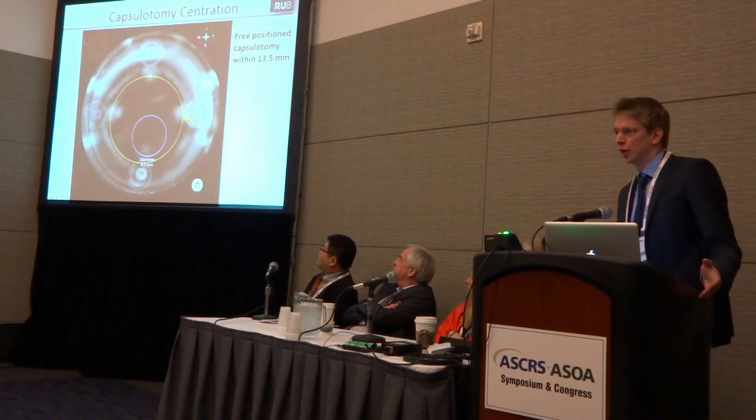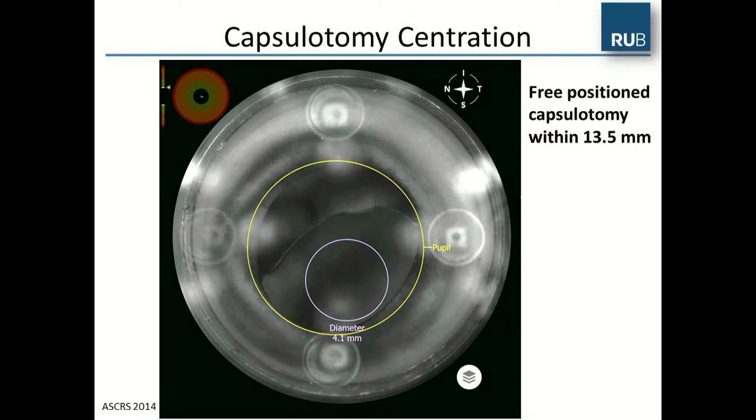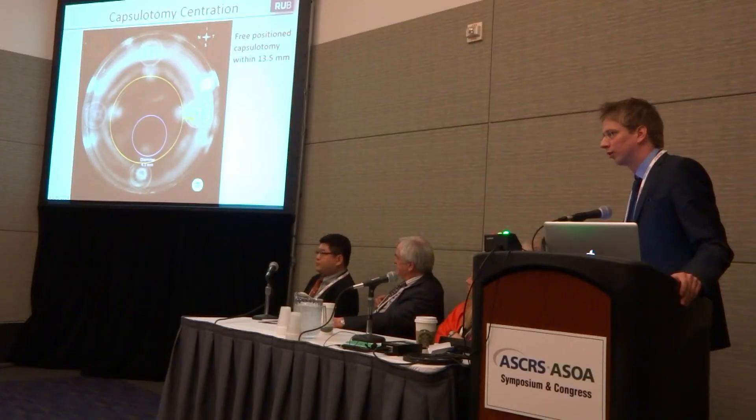After docking, we performed the surgery under general anesthesia in a sterile environment in the operating area. You can see here the image of the infrared camera. The system is able to position the capsulotomy within the 13.5 mm of the interface. We had to position the pupil a little bit outside of the iris, because there is an integrated safety zone of 500 microns, and we adjusted the system to get as close as possible to the center of the lens.